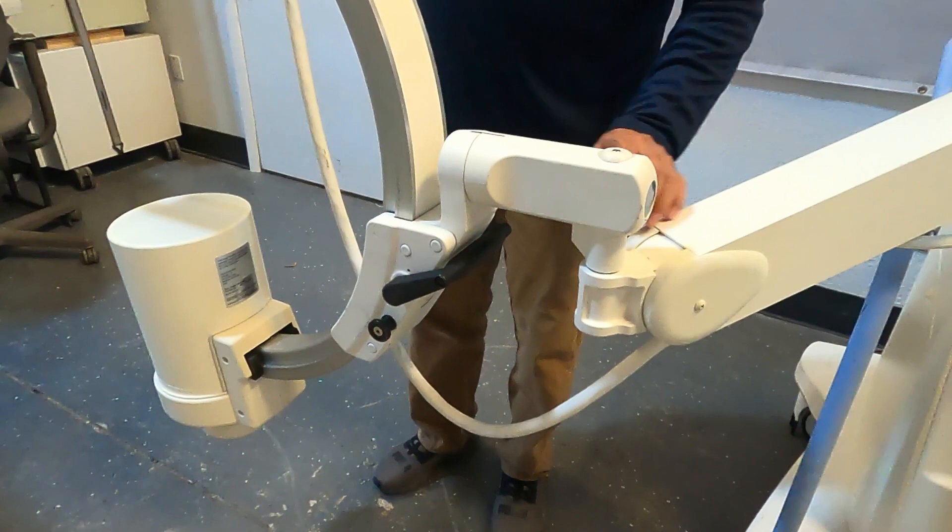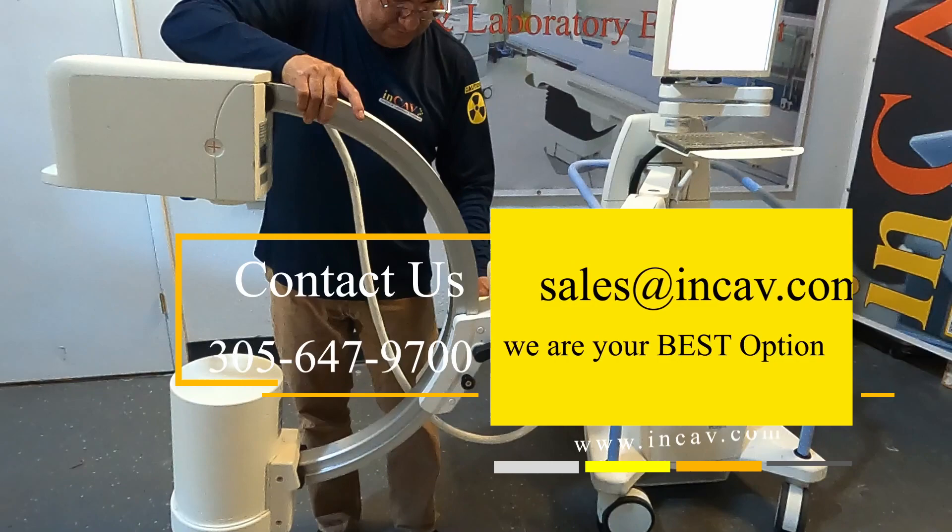This is the brake. Just release and move the C-arm into the right position, then lock it back again so it doesn't move during the procedure.